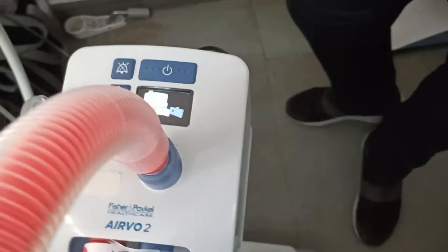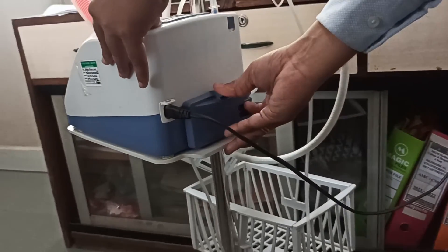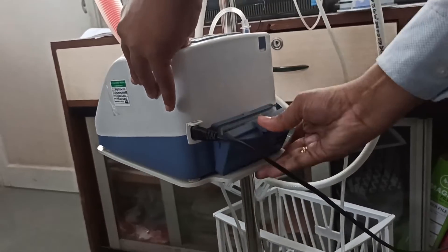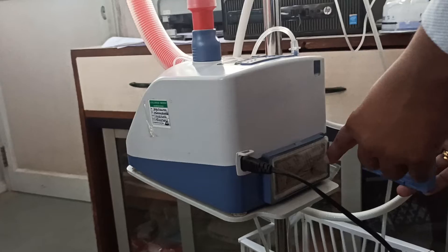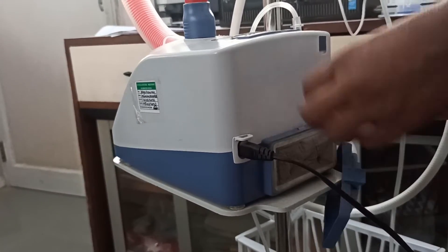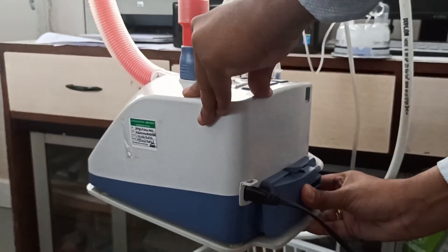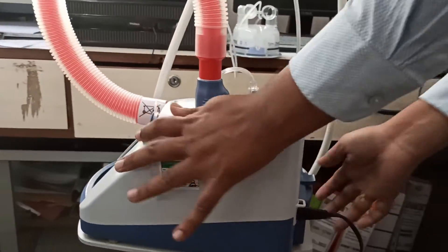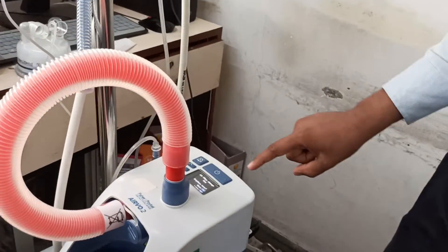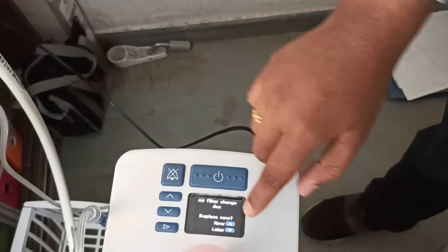Come to the backside — you can observe these are the air filters. You have to press it like this and open it. This is the air filter; you have to remove it and change it with a new one. After changing, you have to fix it back like this.